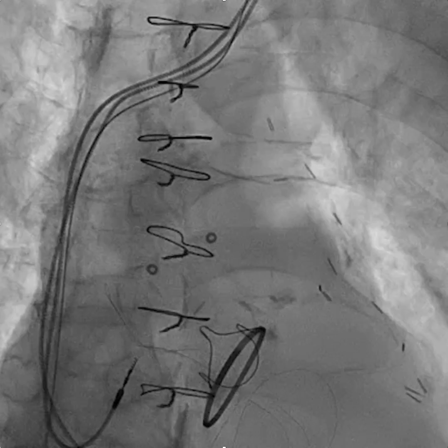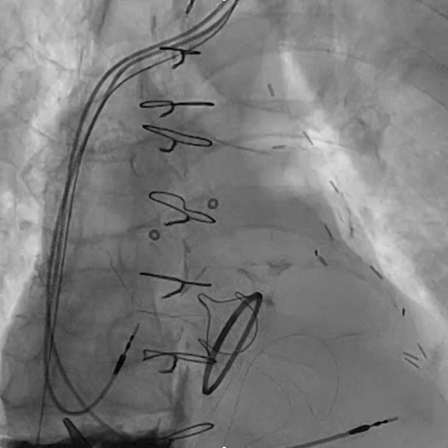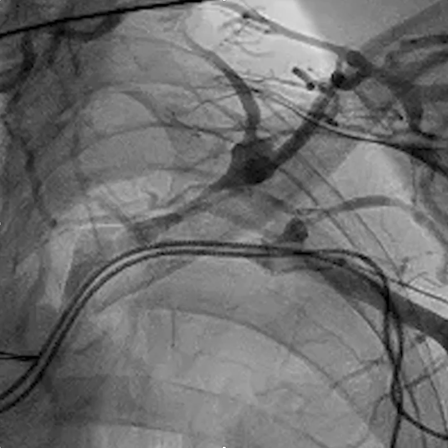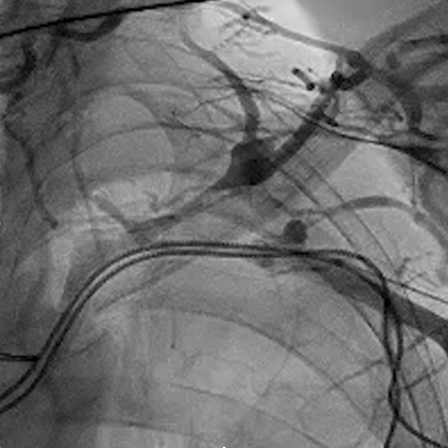From here, it's just a matter of exchanging to a more supportive wire from the glide wire and performing venoplasty. We'll talk about that more in subsequent videos, but this is an example of how to use the micropuncture kit with stiffened dilator in a patient with subclavian obstruction.